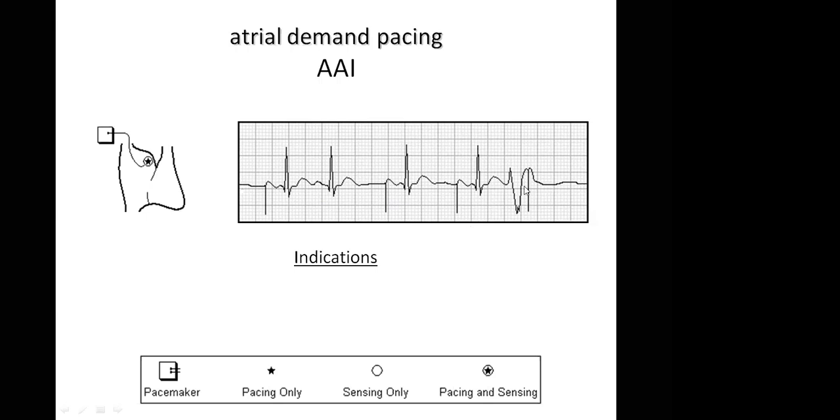Now, I'm sure your question was what was happening here. As Dr. Blessed rightly said, this is an abnormal QRS, right? And if you compare the distance between here and here, and the distance between here and here, it looks like this guy came before his time. So this is less than two big boxes. The distance between here and here, this one is about one big box. And even for the intrinsic one, it's more than two big boxes. So that justifies that this guy is a premature beat.